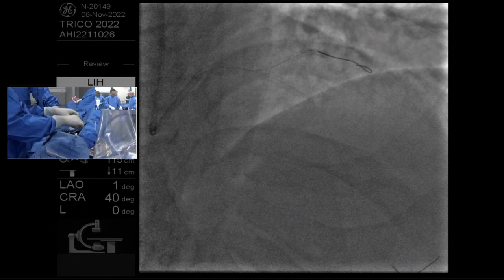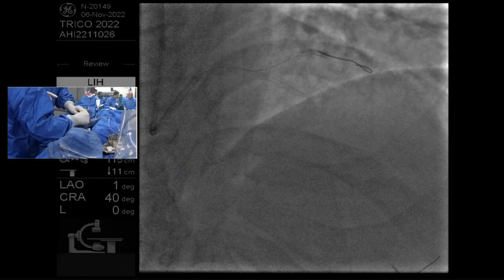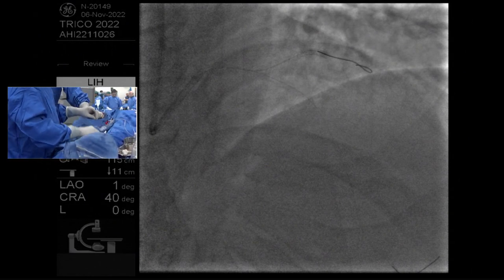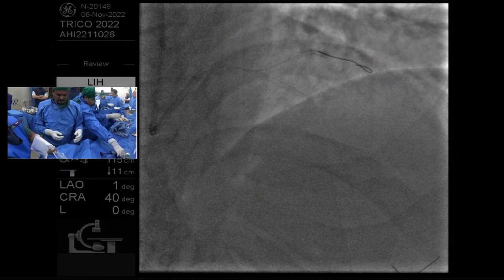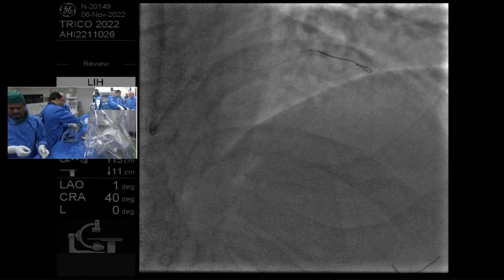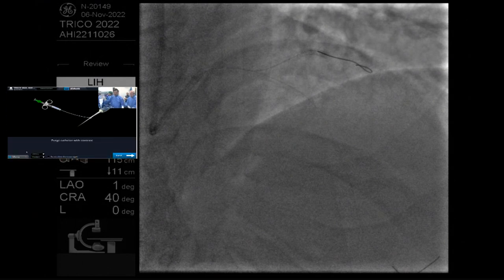Yeah, I usually open it first, because you're not doing the imaging to assess the severity of the lesion. Absolutely. You are doing the imaging to assess the size of the stent you're going to use, or whether or not you need additional treatment strategies like atherectomy or IVL. Mauricio, you bring up one of the most important points around imaging, which is that outside of the left main, there are no imaging cutoffs to tell us that we should intervene. Exactly. There are imaging cutoffs that tell us we can defer intervention. It's physiology, the patient's symptoms, LV dysfunction that drives us towards revascularization or not. That's very well outlined in the new revascularization guidelines.